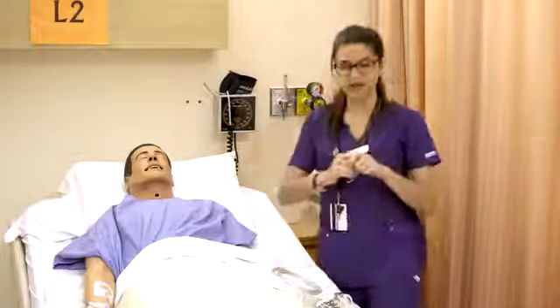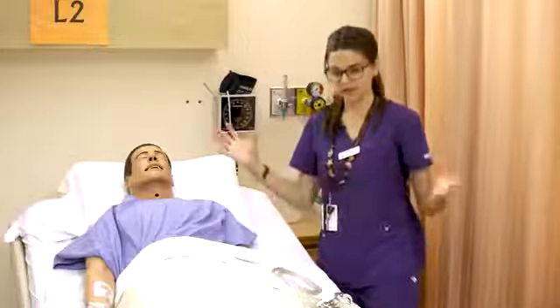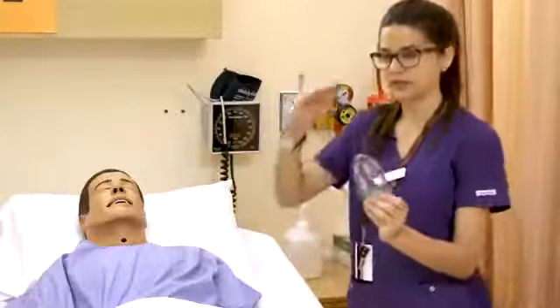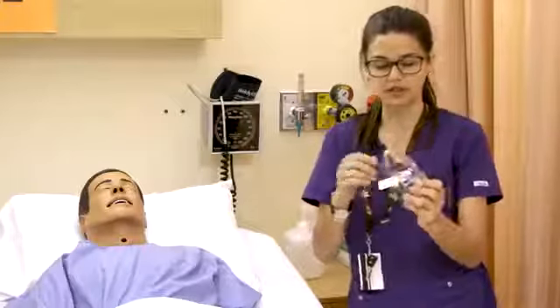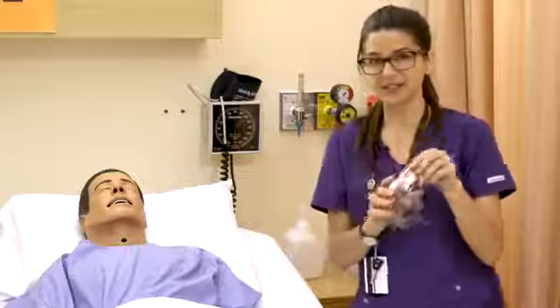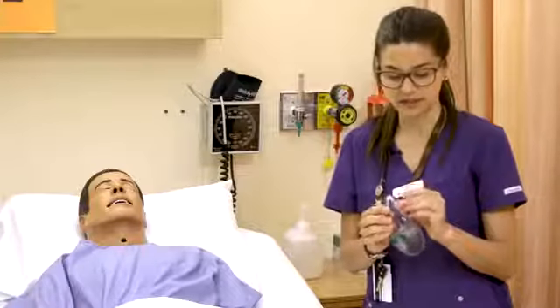So when you open that bag, be careful that you don't have everything flying out all over the place. But starting with the simple face mask, because that's sort of stair-stepping our approach to oxygen delivery, this is where you go from 6 to 10 liters and then deliver 35 to 50% FiO2.